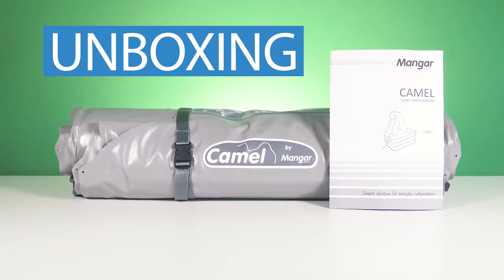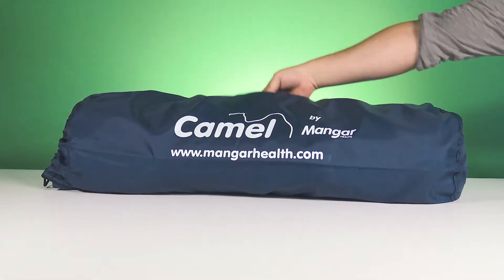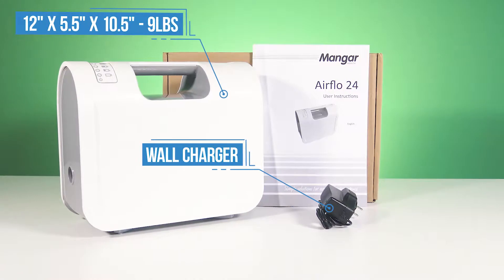When you open the Camel, you'll immediately notice how small and light it is. It packs easily into the included carrying bag and only weighs 15 pounds. To match that portability, the included battery-powered compressor only weighs 9 pounds.